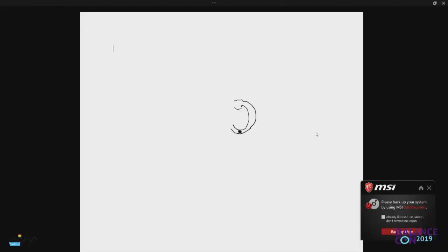He goes to the right lateral position. If I roll to the right lateral, and I am seeing this person from the head end, isn't this how the horizontal canal will be oriented with respect to gravity if this is the ground? Yes or no? Yes.